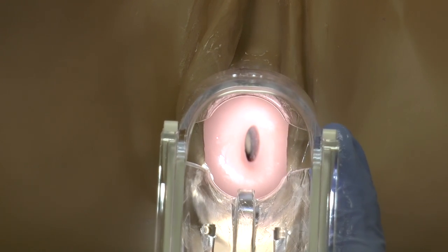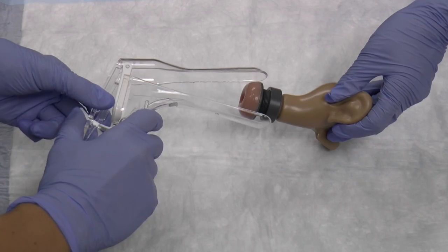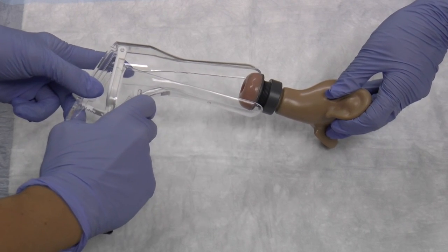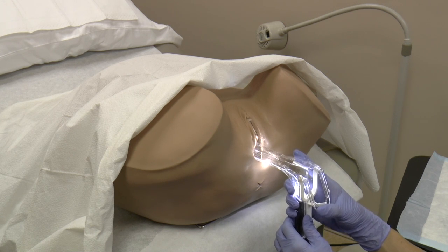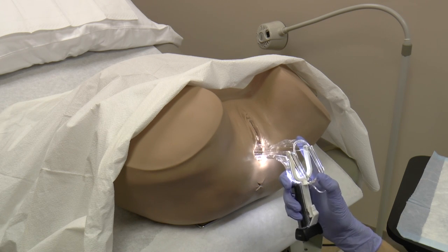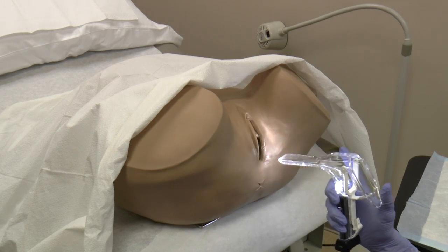Once you have completed your cervical inspection, slowly remove the speculum. Be careful not to close the speculum too soon because the cervix may be caught between the blades. Be careful not to close the speculum too late because the upper blade may hit the urethra. Inspect the walls of the vagina as you withdraw the speculum. Ensure the speculum is closed by the time it exits the vagina.